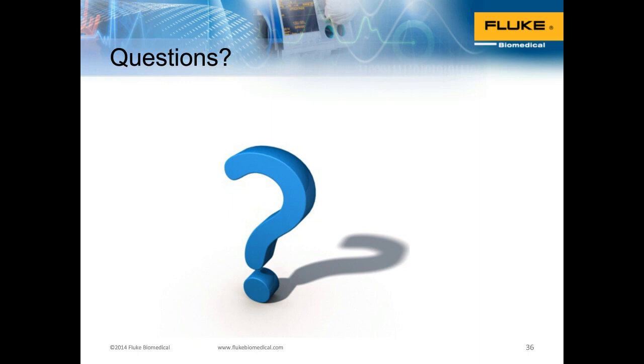Are there plans to make the reports into a PDF form? Yes. Printing on paper requires us to scan it before we can add it to our database, and a PDF would be much easier. Yes, absolutely. So with our analyzers, if you use integrated automation in the IDA5 and you want to print out of it, you can get the data in PDF form.